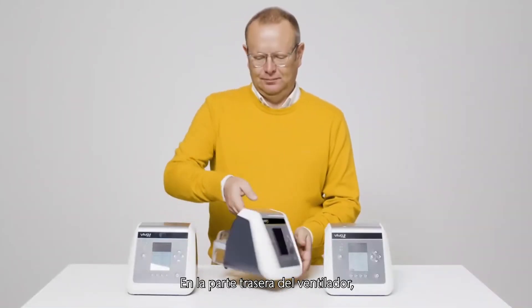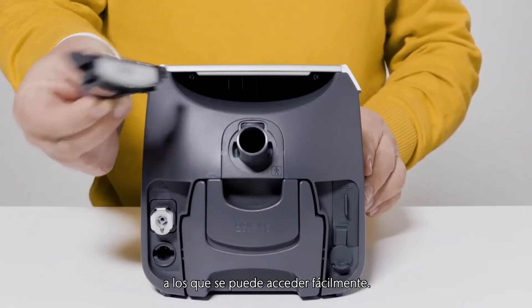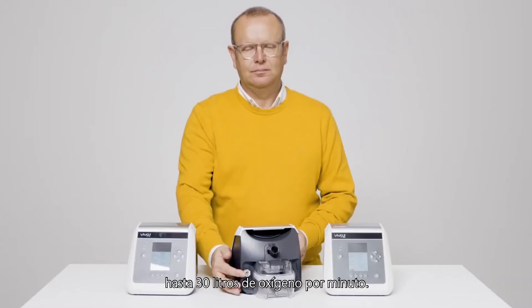On the backside of the ventilator, you will find the air inlet filters, which are easy to access, as well as the oxygen inlet, allowing to add up to 30 liters per minute of oxygen.